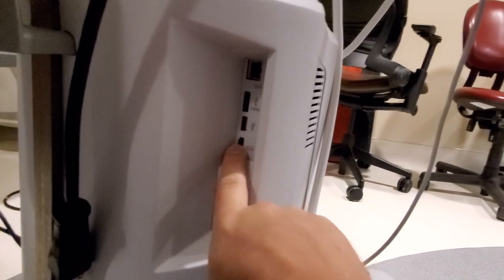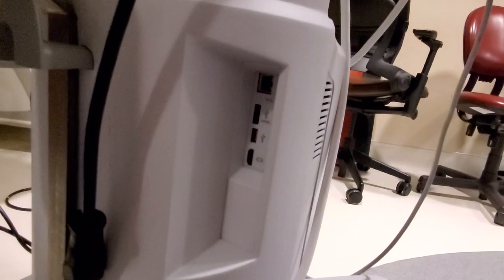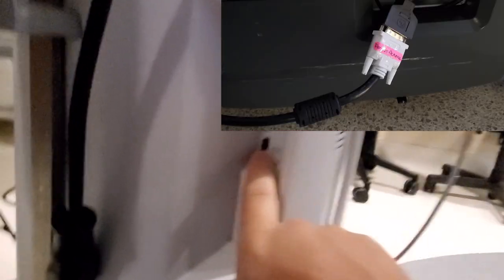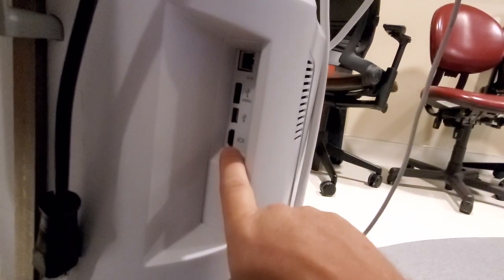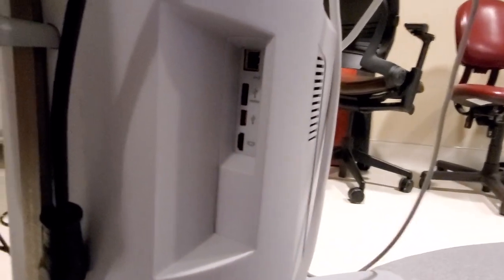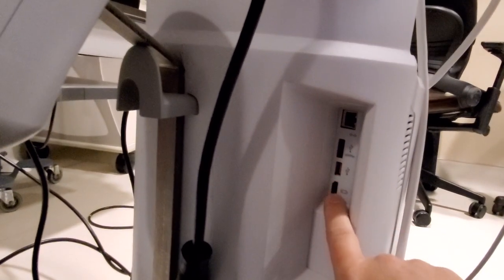This is the point where things are going to break. Either the cable, let's say somebody yanks it accidentally. Well, guess what? That yank is being applied to this board. And I guarantee you, with all these connections right here, that this board is just regular surface mount and is probably kind of frail. I see this with microscopes, some of the new Zeiss microscopes. I wish I had better video of the breakages that I see there. And obviously this ultrasound right here is going to be a very expensive board when this guy breaks.